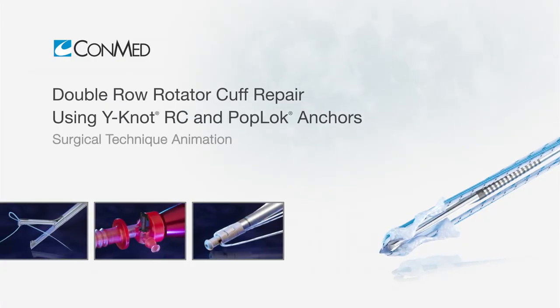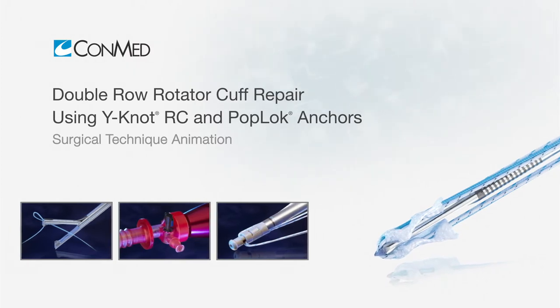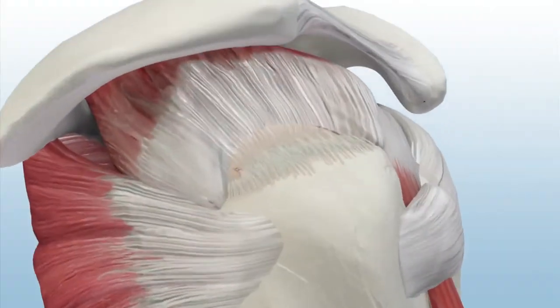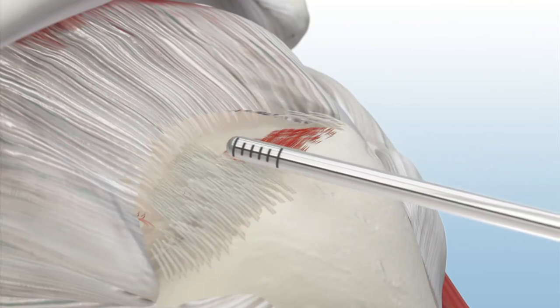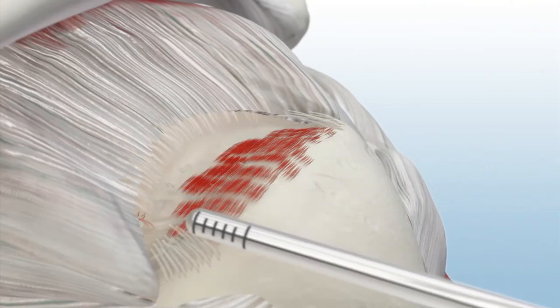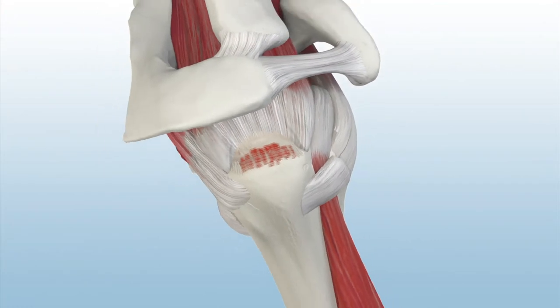The Y-Knot RC Self-Punching All-Suture Anchor and PopLock Knotless Suture Anchor are used for secure double-row rotator cuff repair. To begin, prepare the footprint in subacromial space using a ConMed dual-purpose shaver blade and the Edge Bipolar Arthroscopic RF device.